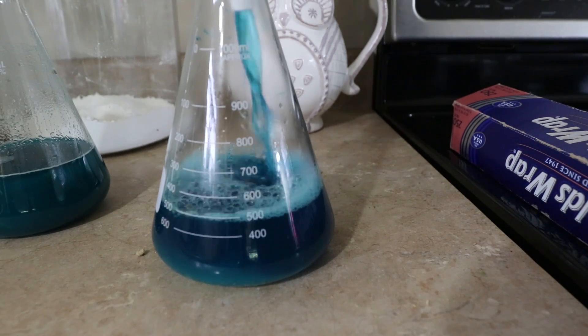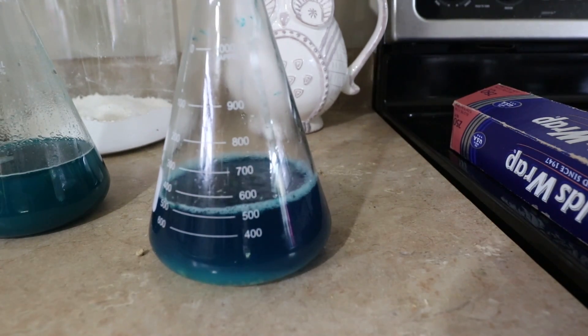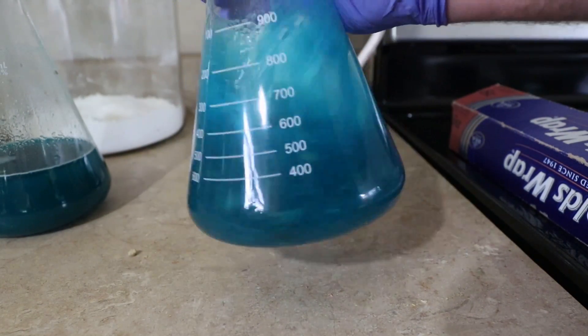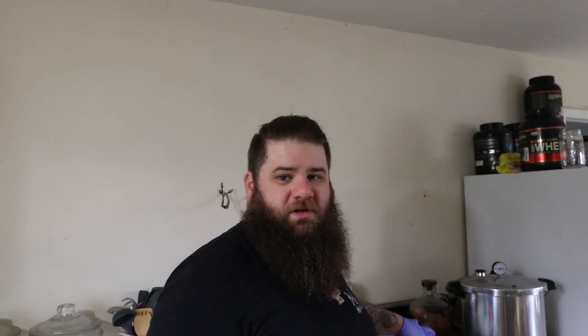Once you have your flask, mix it up by hand — just shake it by rotating your wrist, a little flick of the wrist. Then take polyfill, which you can buy at craft stores — I get mine from Walmart — wad up a bunch, stuff it down in the neck of the Erlenmeyer flask, then take some aluminum foil and drape it over the top and give it a little twist so it holds on really well. Now that is ready to put into the pressure cooker and cook at 15 psi. I do mine for 30 minutes; some people only do 15 minutes, but 30 has worked really well for me.